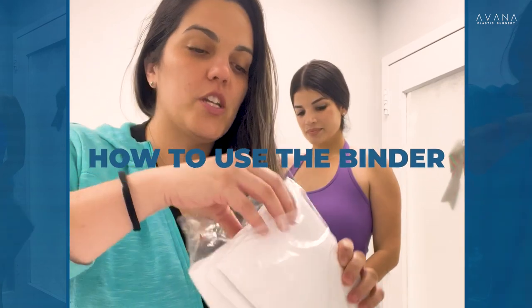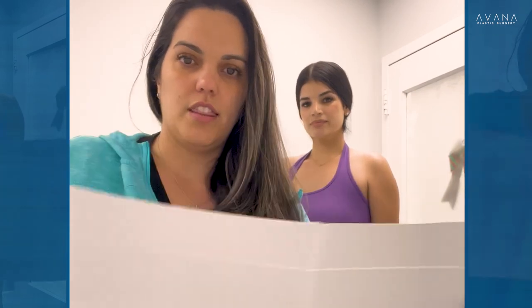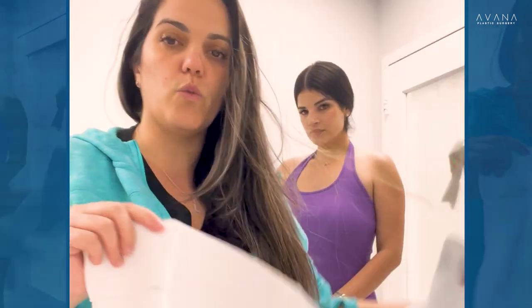Hi, this is Lizzie, the Tosco numerical assistant. This is the binder — I'm going to show you how to use it. Make sure you're going to use a four-panel binder: one, two, three, four. You have a belt on one side and the other side.